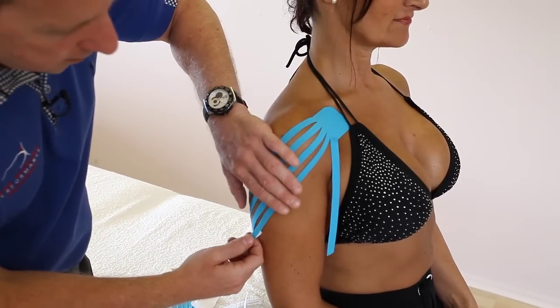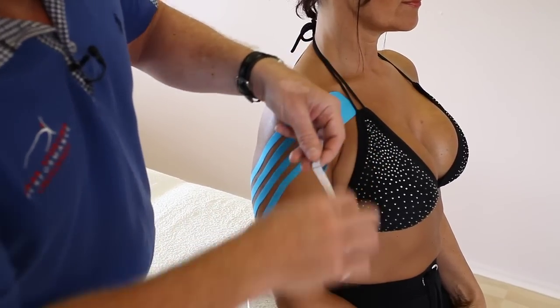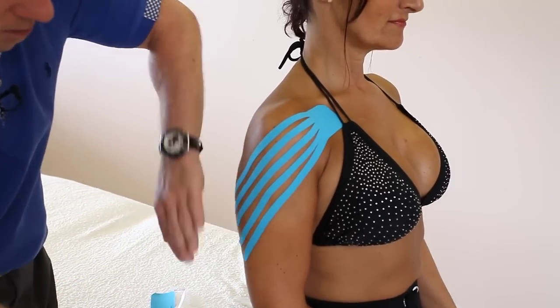The good thing is with this tape is you can leave it on, you can shower, leave it on for five days. You'll probably find after about three to five days it starts to lift, especially when you're showering and such.